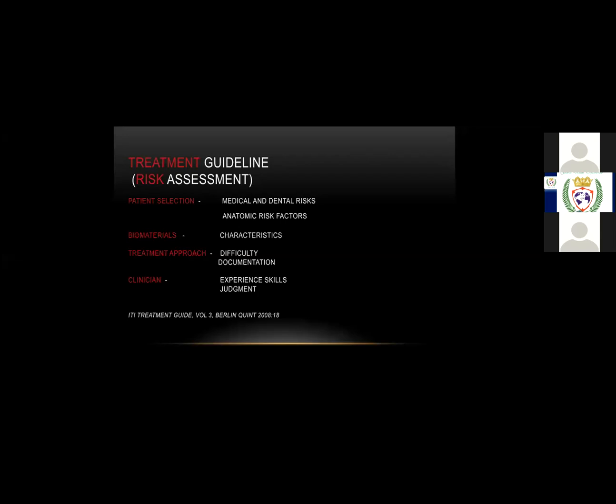So what I can say, when we look into different implant systems, only around 8 to 10% of implant systems are original, but the rest 90% systems are clones of these 8 to 10 original systems. They have just copied and made 1 or 2 changes, and they are doing marketing. So just don't get into any system which comes into the market or in your particular region you're practicing, go into the system and look into the history and look into the product, look into the surface treatment and assess the condition and decide.